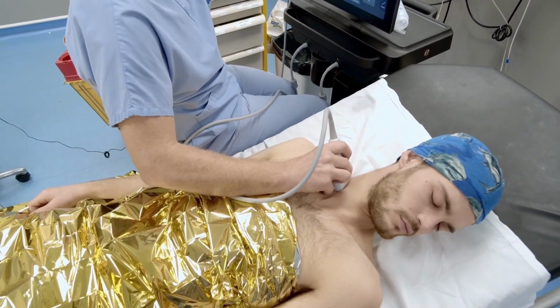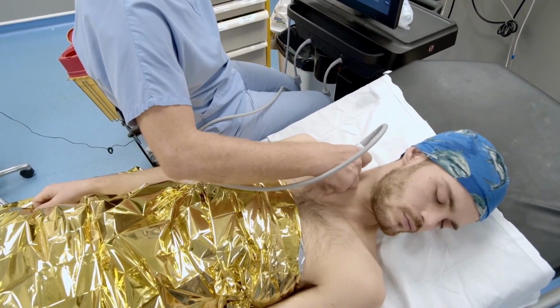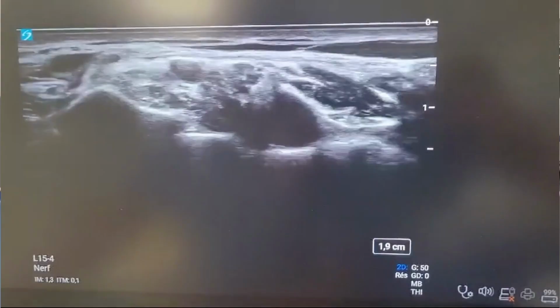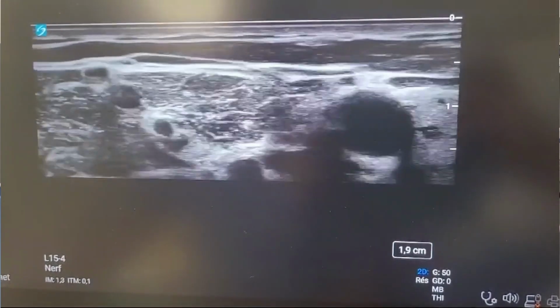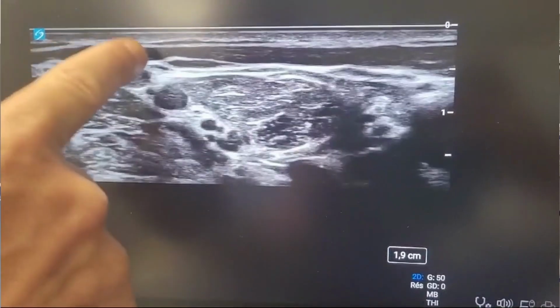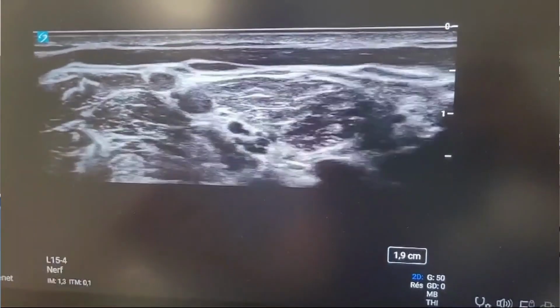Here we have the sternocleidomastoid. As you follow along, you see we have a slightly unusual configuration again, with C5 and C6. By narrowing the field, we'll get better resolution. There you go, C5, C6, we find the anterior scalene and the middle scalene.